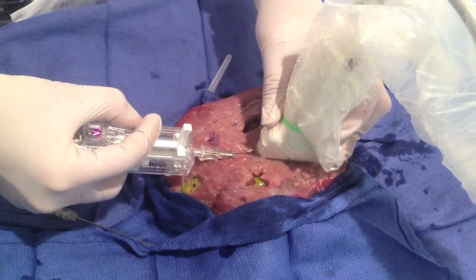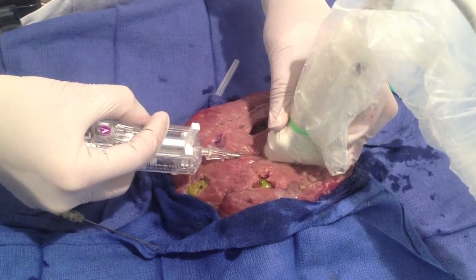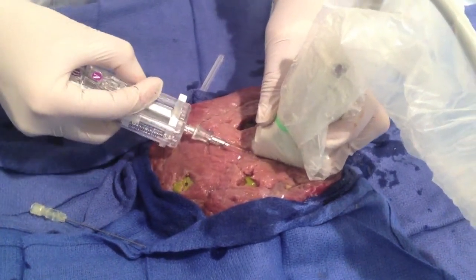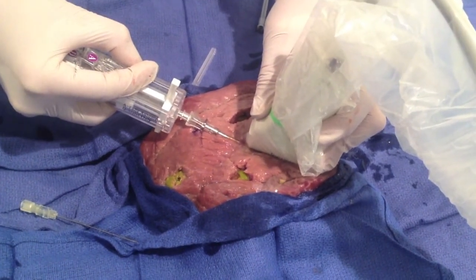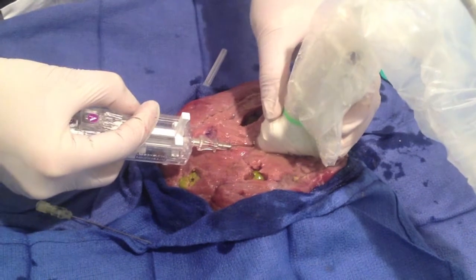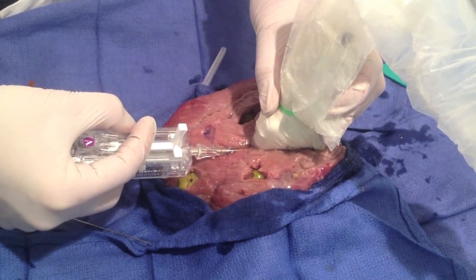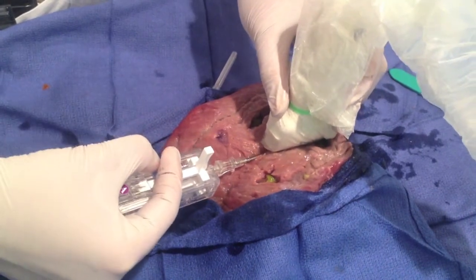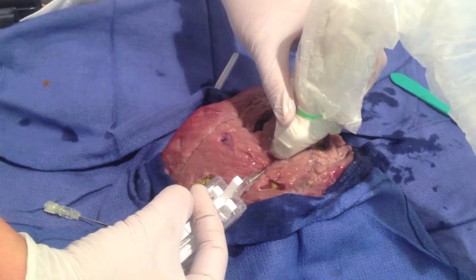So you see here that she's worked out that, in this particular case, her needle is on the far side of the lesion away from her, and she's now going to rotate both the needle and the transducer in a clockwise direction. Looking carefully at the screen, you can see the lesion's the center of the fulcrum. Now, if her needle had been on the near side of the lesion, she would have moved it exactly the same, but in an anti-clockwise direction like this. So again, the needle is on the near side of the lesion, it's towards you. She's going to rotate the needle and the transducer as a unit, with the lesion being the fulcrum, and that will line it up nicely with the center of the lesion as shown on the diagram.